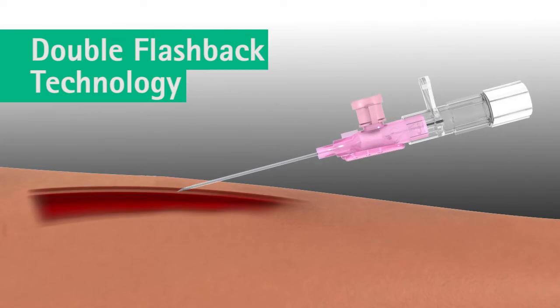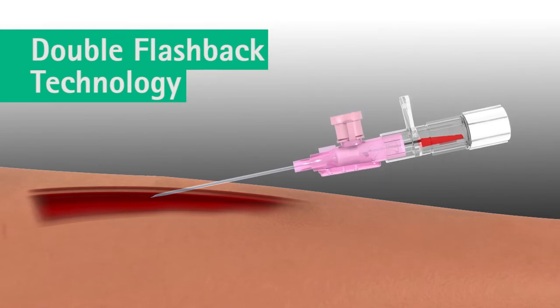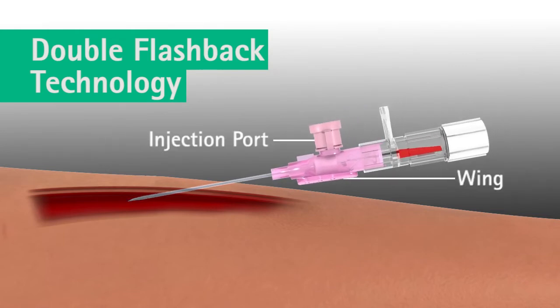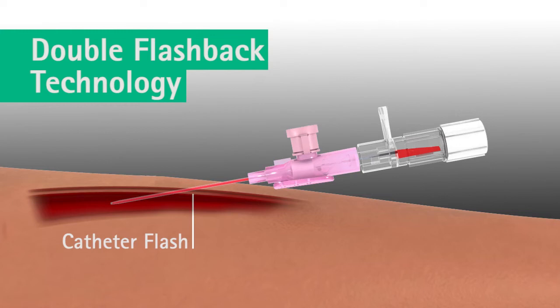Upon insertion, the first flashback of blood — needle flash — is visible in the clear flashback chamber, confirming the needle tip is in the vein. Using the injection port on the catheter hub or using a wing, the catheter is advanced forward off the needle into the vein. As the catheter is advanced, a second flashback — catheter flash — occurs between the catheter and the needle, confirming that the catheter is successfully in the vein.